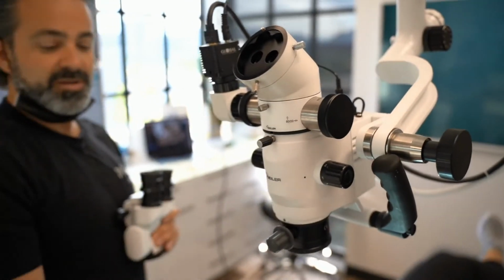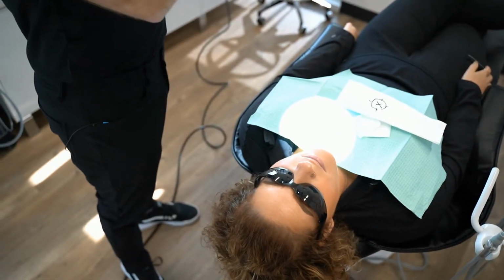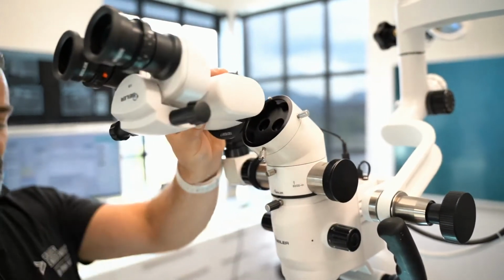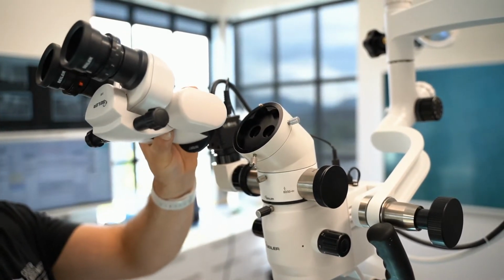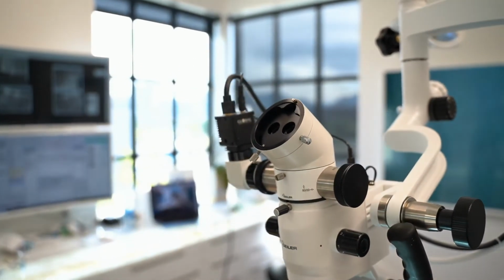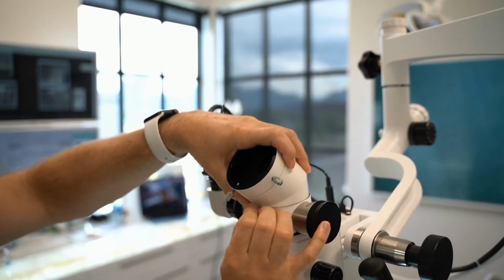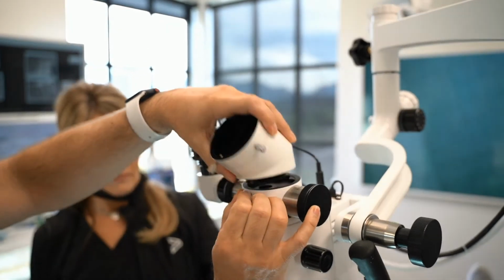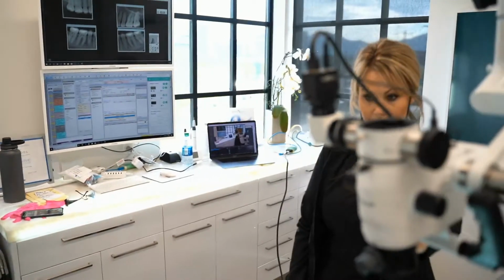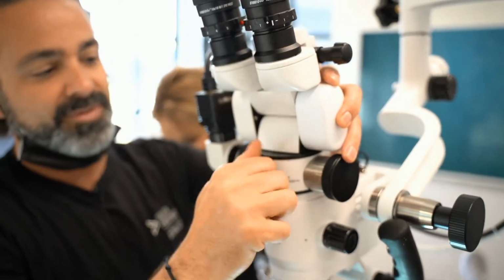Because I work at 12 o'clock over the head, this angle that's up here extends my eyepiece over her head. If I work from a side position, this becomes important for the correction, but the distance away is not that important. If I were to take this piece off, Vicki, will you hold my arm down since my weight's changing? These things are balanced, so I'm going to have her hold that down. If I were to take that off and put my eyepiece on, which is the more common configuration, it does a couple things.